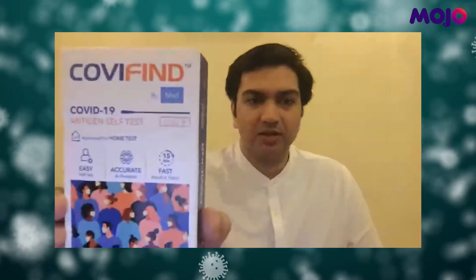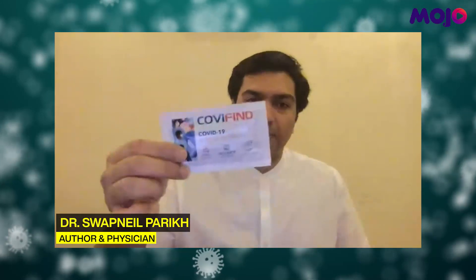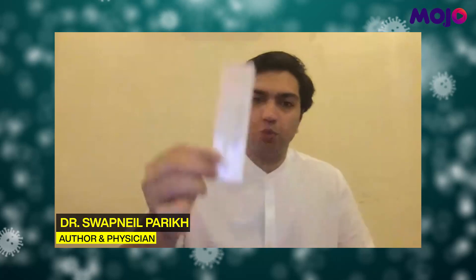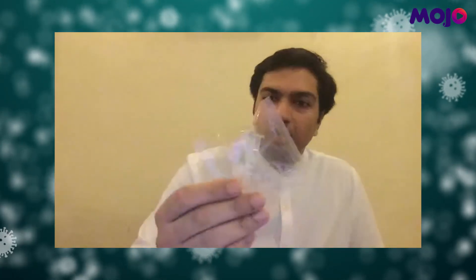This is a self-home rapid antigen test, co-developed by Merrill. In a little aluminium wrapper it contains the actual test kit. There is a swab, an extraction tube with buffer pre-filled in it, and an instruction booklet. Inside the instruction booklet you will also find a disposal bag.